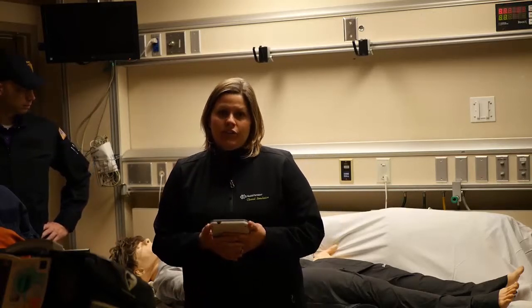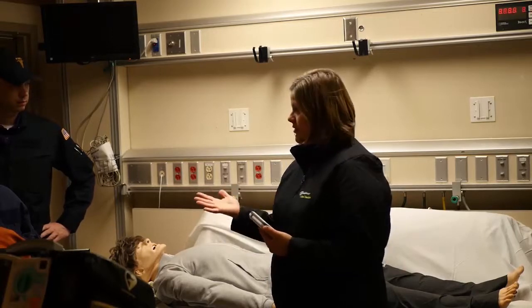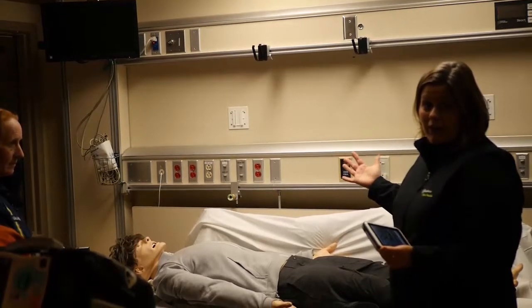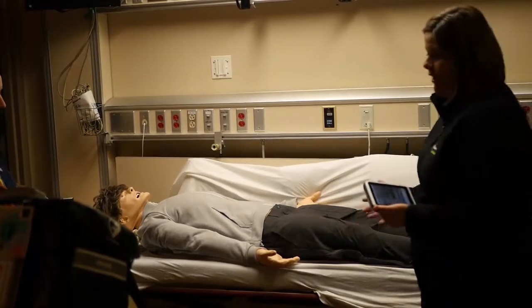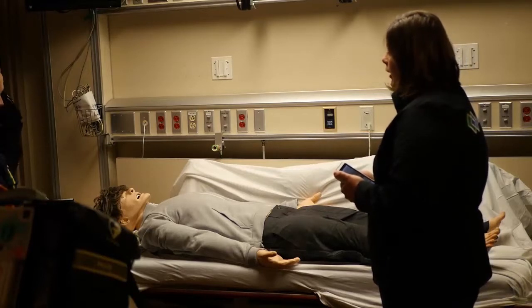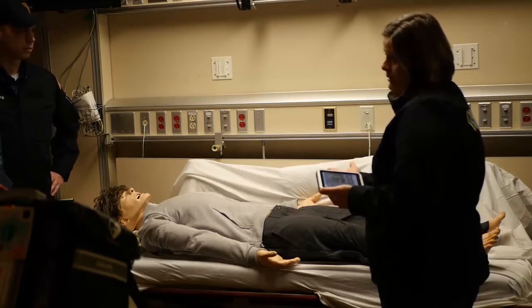And so to start with the scenario, I'm going to do a pre-brief for Krista and Hans. You can see we have our patient here. This is our home setting. So really it's an old hospital room, but we've made just a few simple changes to make it look like our patient is at home laying on a couch. And so Krista and Hans, when you respond to the call, you'll come into the patient's home and treat the patient like you would in real life.